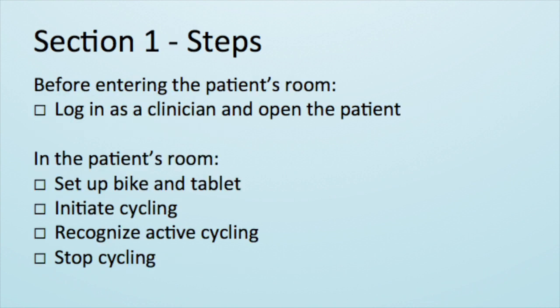This is a list of steps you can refer back to ensure that you are setting up and executing cycling efficiently. Before entering the patient's room, log in as a clinician and open the patient. In the patient's room, you will set up the bike and tablet, initiate cycling, recognize active cycling, and stop cycling.